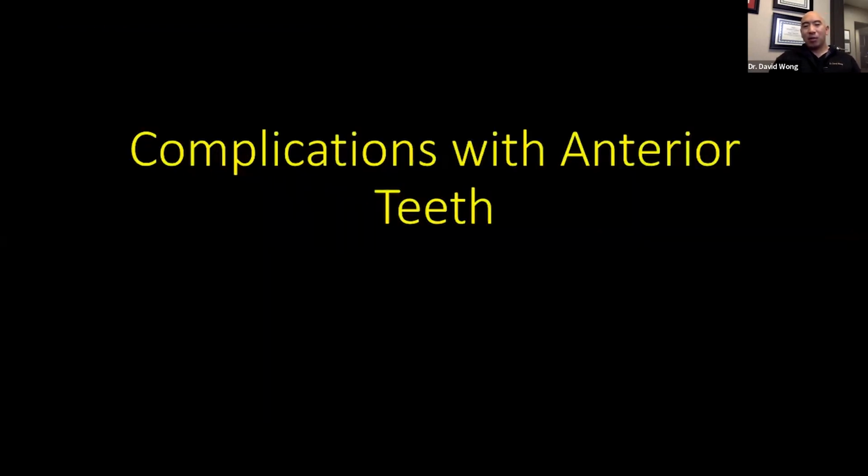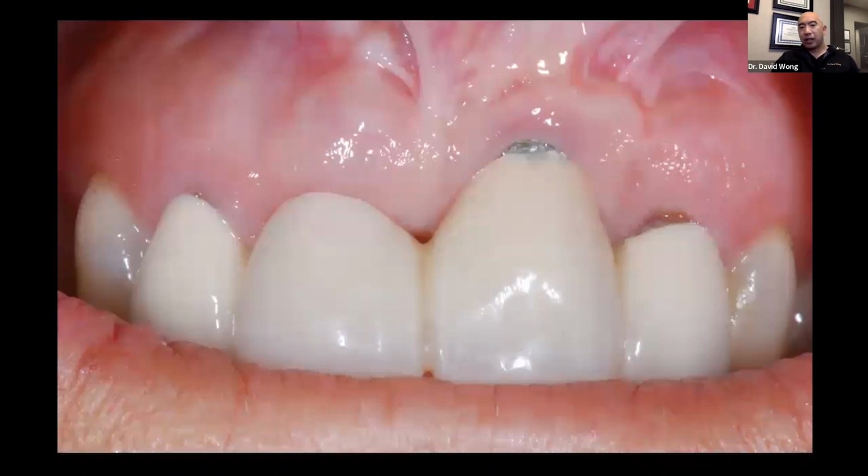So, complications with anterior teeth. I'm going back to this photo here. I don't know too many of us that would be comfortable treating something like this if it came into our office, or worse yet, if we did this and this was our patient and that was our implant. I don't know that any of us approach these cases with a whole lot of confidence usually. Certainly we can sit around online and talk about solutions, but ultimately what I want to train people to do is how to avoid these types of situations, because they are easily avoided, especially with implants.